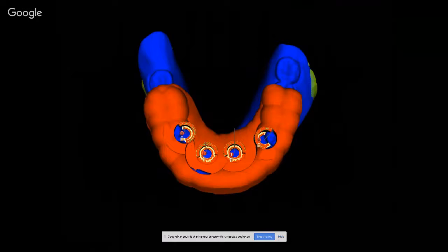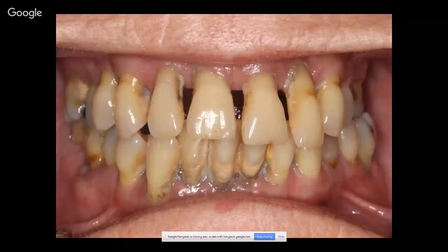So taking a patient that has advanced periodontal disease and going from something like this, on the day of surgery, we extract all the top teeth, remove all the bottom teeth, place our bone guide on the mandible, place and torque out all of our implants, immediate load with multi-unit abutments, take our titanium cylinder temporary abutments, torque those in, convert our 3D printed denture onto our 4 implants, and immediate load the lower.